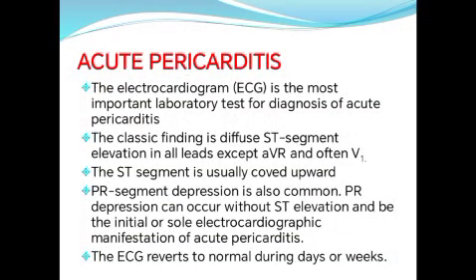In acute pericarditis, the most important diagnostic tool is the ECG. The classic finding is diffuse ST segment elevation in all leads except aVR and sometimes V1.